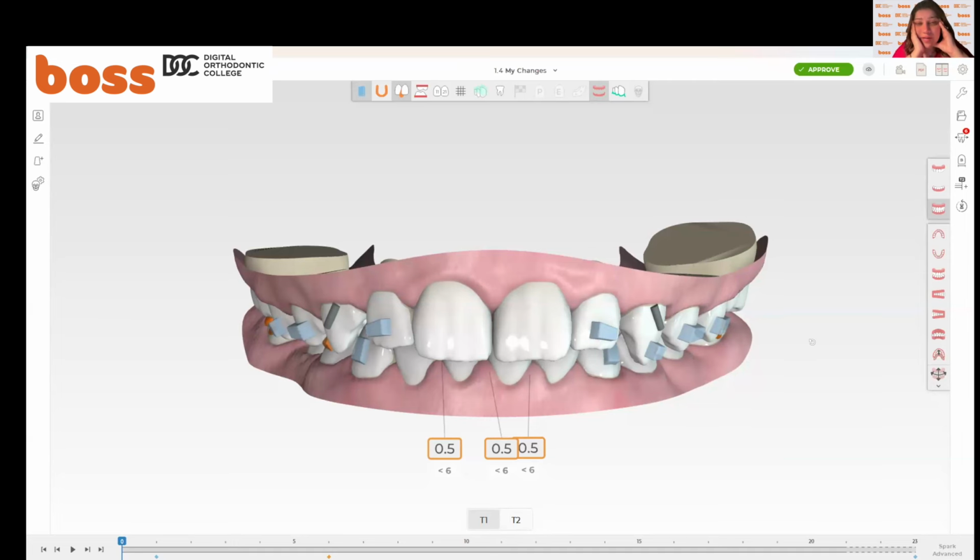So, what are you going to talk about the vertical? When I say upper incisor display was 70%, what does it mean? Do not intrude upper incisors. Perfect. Now, this is what we're seeing at initial. So, how are we going to correct deep bite? How are we going to open it up? We can't intrude upper. Lower posterior. He's growing. Yeah.